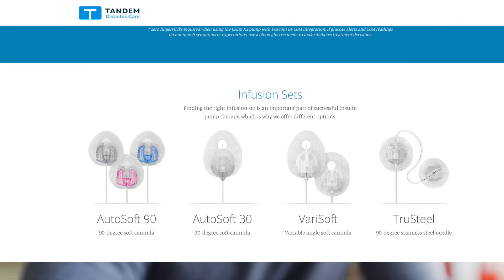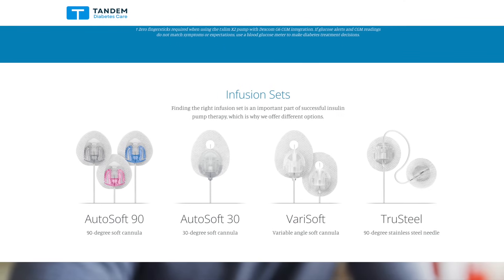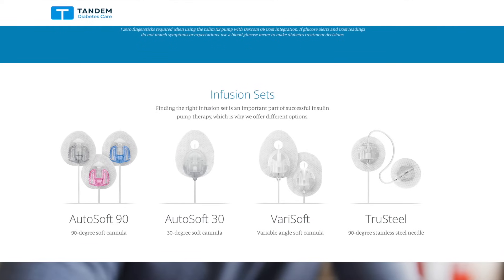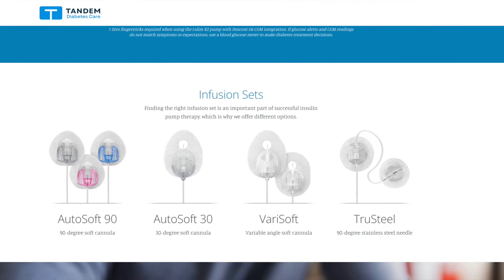Other options include AutoSoft 30 where the soft cannula is inserted at a 30-degree angle, Very Soft which has a variable-angle soft cannula, and True Steel which does not use a soft cannula but an actual needle.